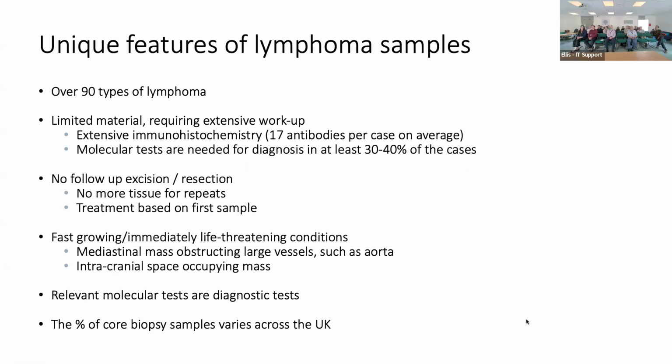Everyone's going to say why their specialty is so special. I'm going to tell you why hematopathology is so special: it is truly just two cell types, but we made our life really complex by breaking it down into 90 different subtypes. They're all slightly different from one another, and an awful lot goes into diagnostics as well. You remember Jim showed you they looked at a microscope, breast carcinoma, yes or no. A few antibodies are used by immunohistochemistry, and then they move on to other bits, but they established the diagnosis here.